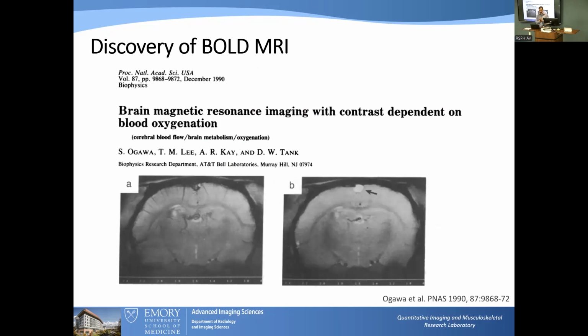And like I said, this is the foundation of the boom in neuroscience of fMRI, where in an animal, they demonstrated through all kinds of different stimuli, breathing different gas mixtures, looking at different pharmacokinetic experiments. They even injected insulin to look at different changes in metabolism of the animal, anesthesia of the animal.